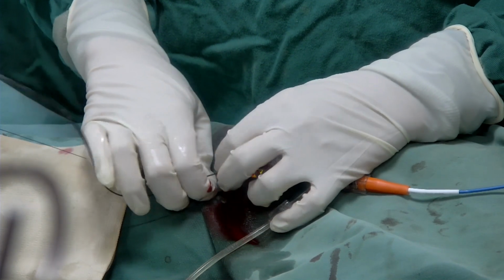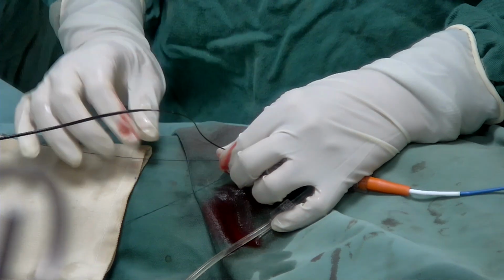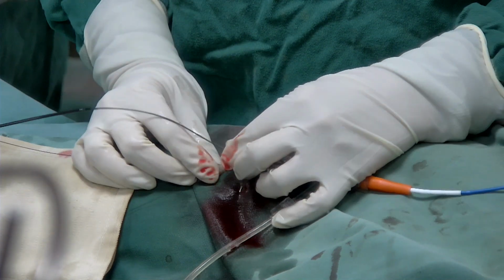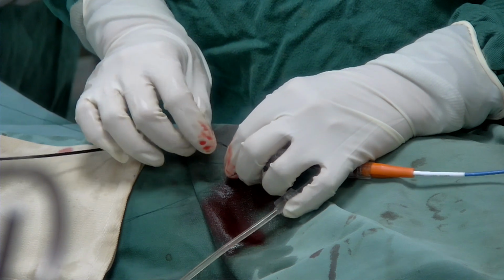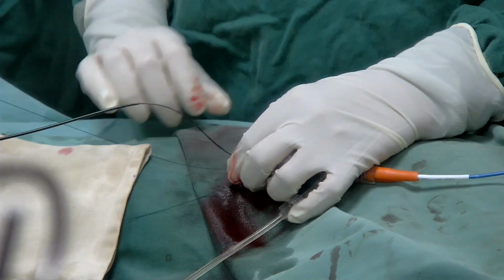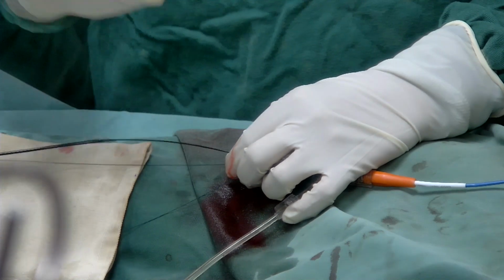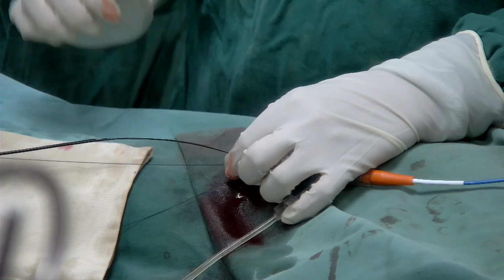And we are in. And I understand that the second marker is the marker for the camera. Right. So wherever our position is, we now need to push some more. So we are good, I think, right? Yes, we are good. This is our position, and we think that we'll be able to see the whole of the lesion.